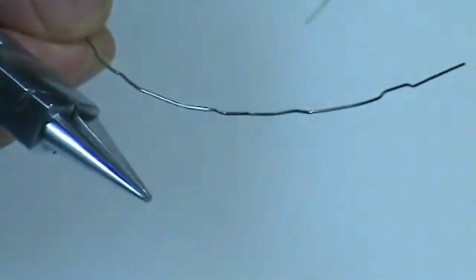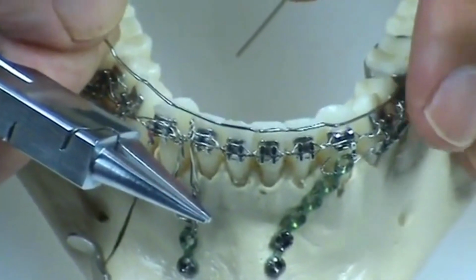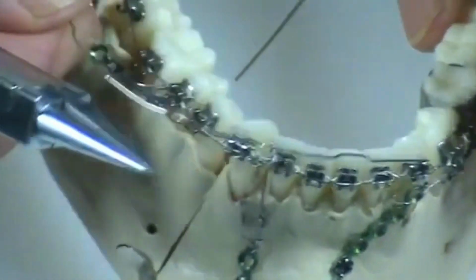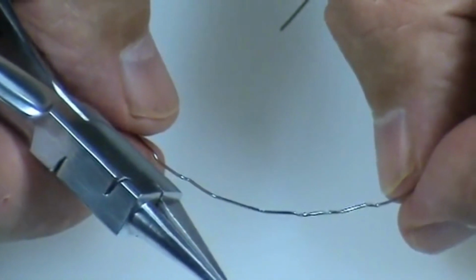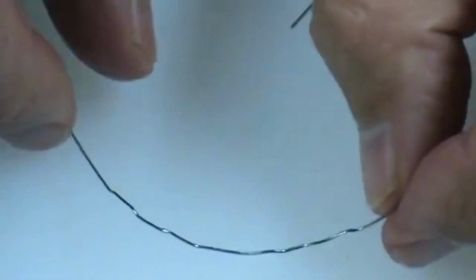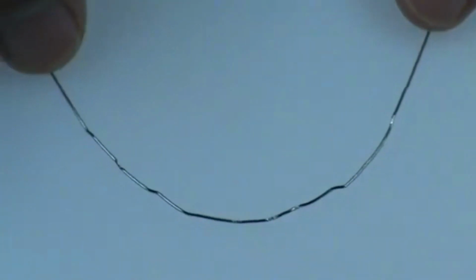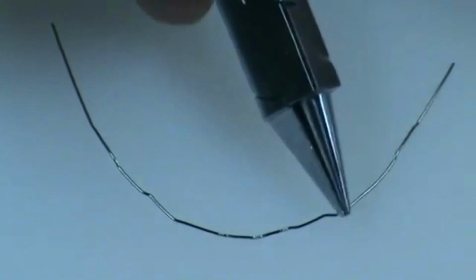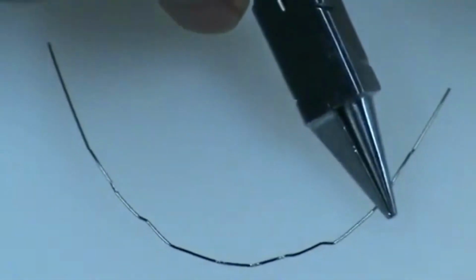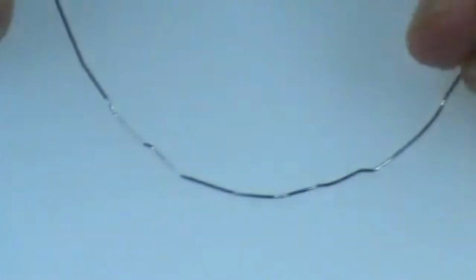Okay, so once the wire adjustment is made, then you would insert the wire yourself, being the one that had made the bends. But before I do that, it says I also need to skew the wire to the left for the midline. Okay, so this is the middle right here where my 4-1 mesial bump is. We want to bend the wire out on this side and in on the other side, right in the cuspid area.